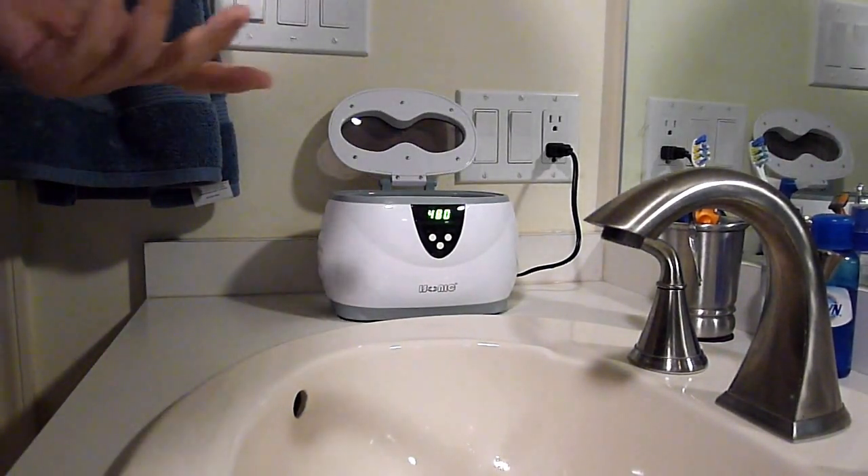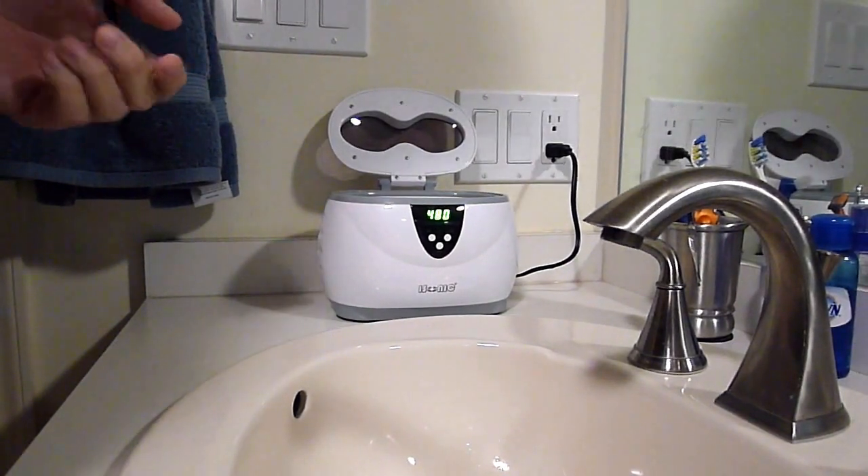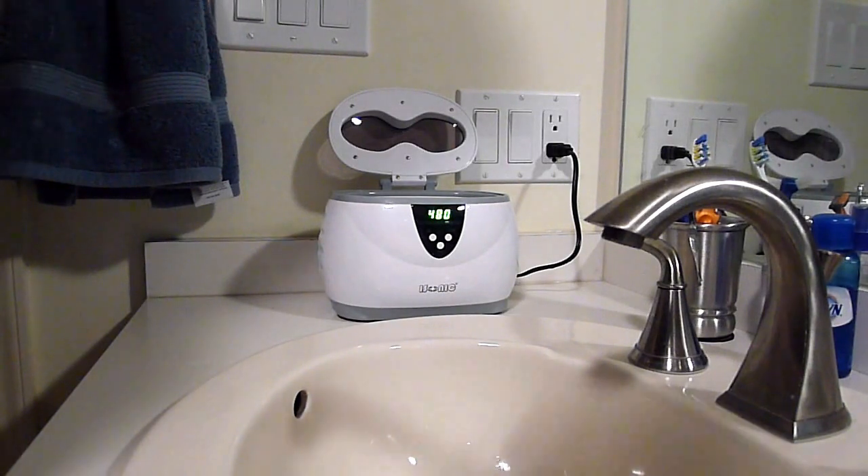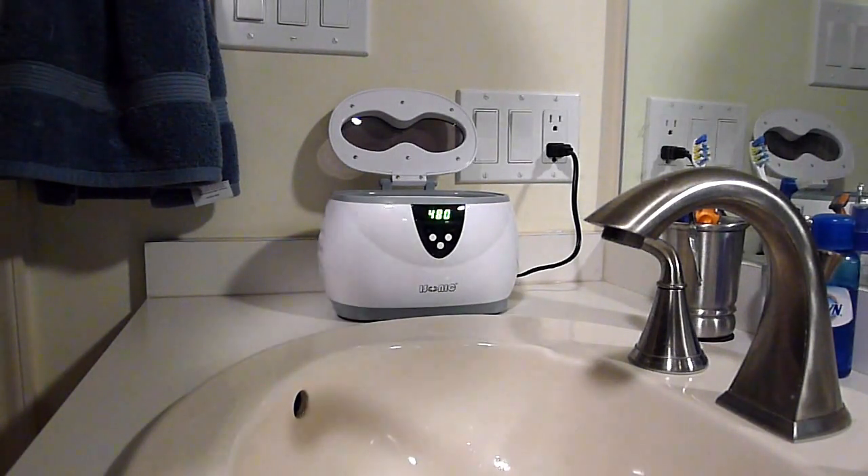The next step in the process is to take the dentures out, and you want to clean off any adhesive or anything on the dentures before you put them in. Let them go in the ultrasonic cleaner without having to remove adhesives — that's not what the ultrasonic cleaner does.